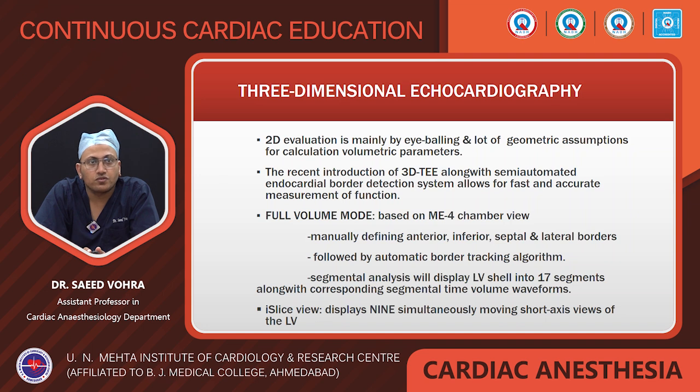Full volume mode is most commonly used in 3D. It is based on the mid-esophageal four-chamber view. In it, the anterior, inferior, septal and lateral borders are manually marked, followed by an automatic border tracking algorithm. Segmental analysis will display the LV shell divided into 17 segments along with corresponding segmental time volume waveforms. In the iSlice view of the 3D, it displays 9 simultaneously moving short axis views of the LV.